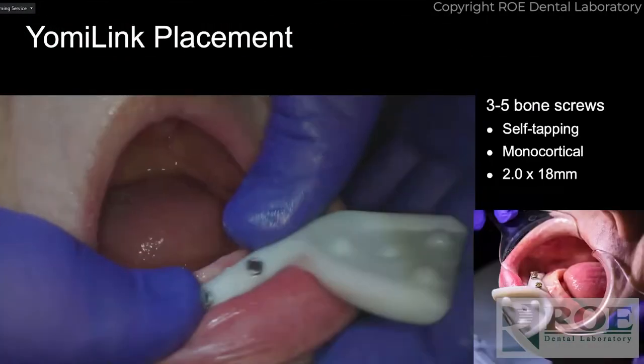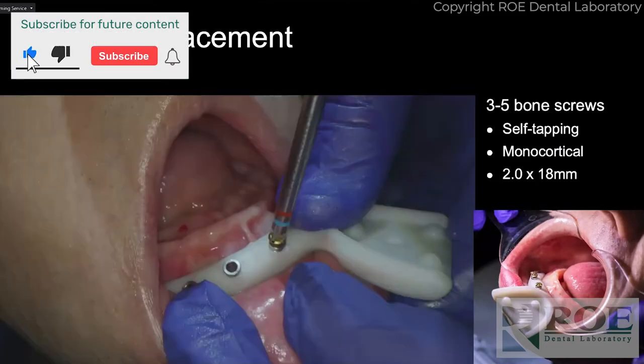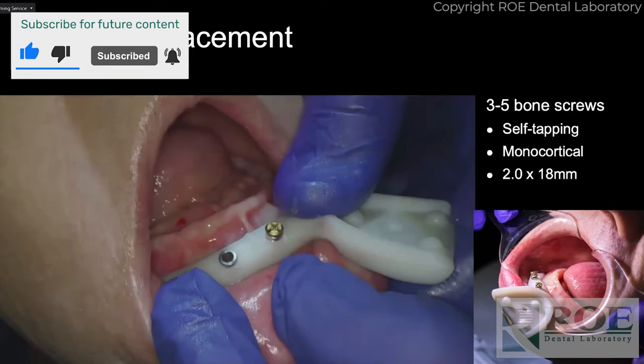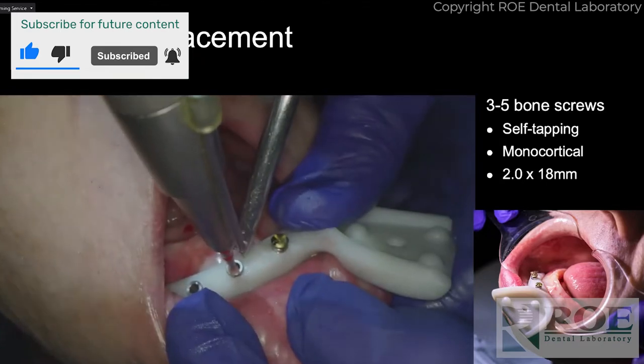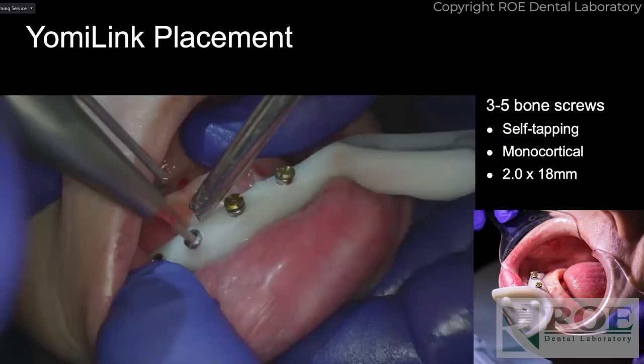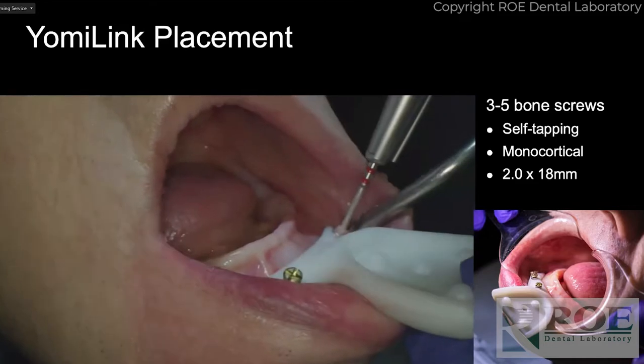This is the Yomi link bone. The patient is a 60-year-old post — we do one arch at a time. I didn't do immediate load because I wanted to move as fast as I could with him, and he's a pretty frail fellow.